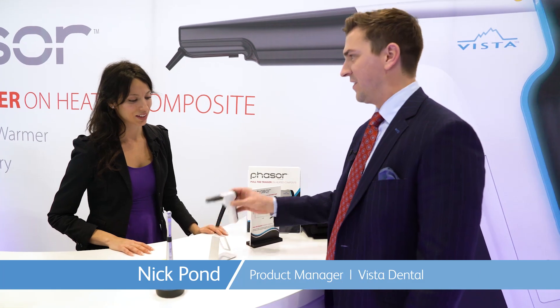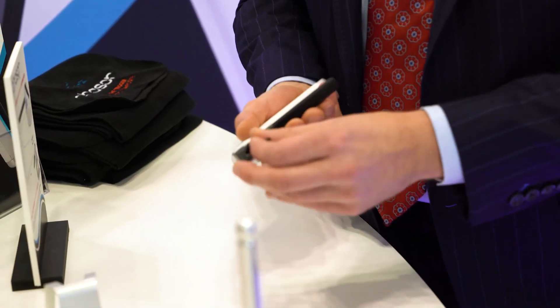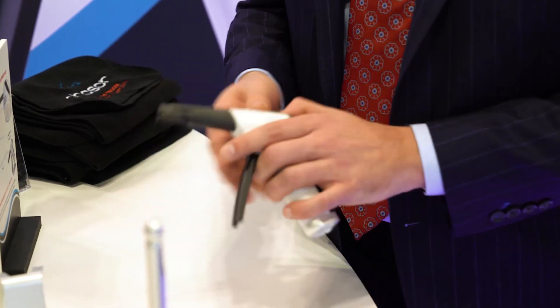Hey everybody, I'm Alyssa Salvatore and we're here at the Greater New York Dental Show at the Vista Dental booth getting a first-hand look at Phasor, a new and innovative product for rapidly heating composites. This is the Phasor — it's designed for rapidly heating composites. It accepts any standard composite compule that the doctor has laying around his office and it's gonna rapidly heat it.